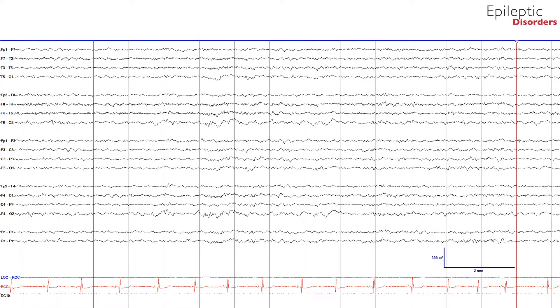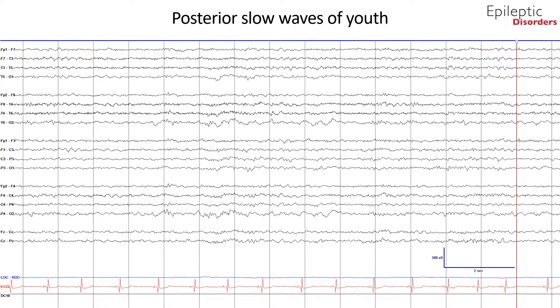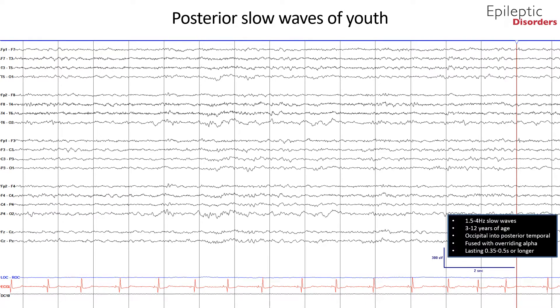In this bipolar montage of a 10-year-old boy, we will talk about posterior slow waves of youth. In preschool-aged children ages 3 to 5 years, trains of posterior alpha waves are frequently interrupted by admixed slow waves, mostly in the range of 1.5 to 4 Hz, extending from the occipital into the posterior temporal and less impressively into the parietal regions. These admixed slow waves, fused with overriding alpha, are called posterior slow waves of youth.